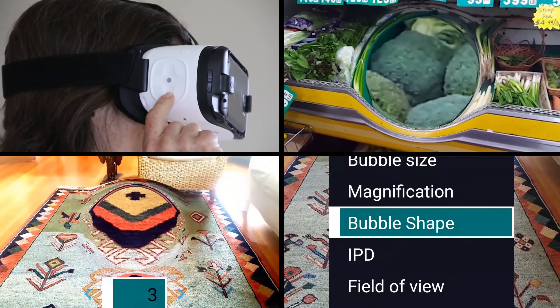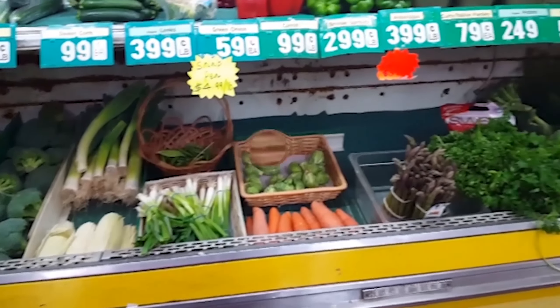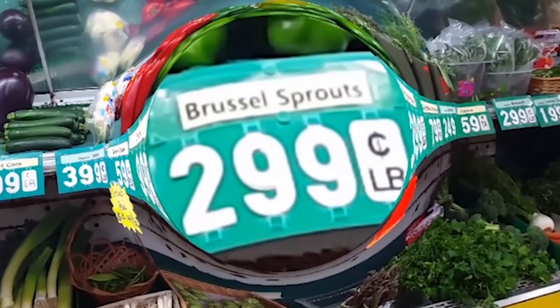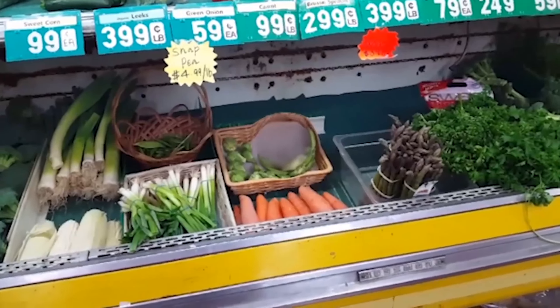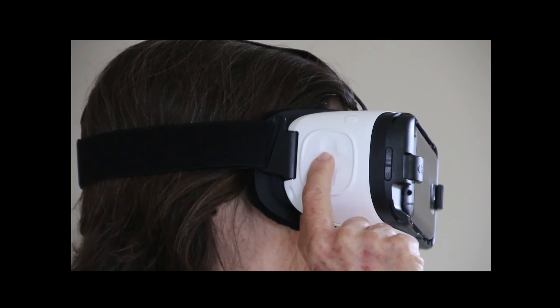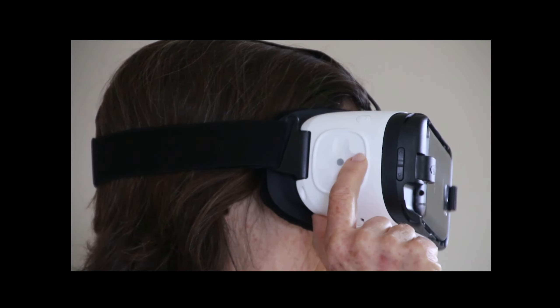As an example, we can take IrisVision out into the real world to see how the device performs in a typical supermarket. The telescope can be trained at the center of the visual field on any item in the vegetable stand or on any price tag. It can be magnified or decreased to examine items in great detail to make it easier and more readable to the patient. The touchpad on the IrisVision device helps patients have more control over their view.